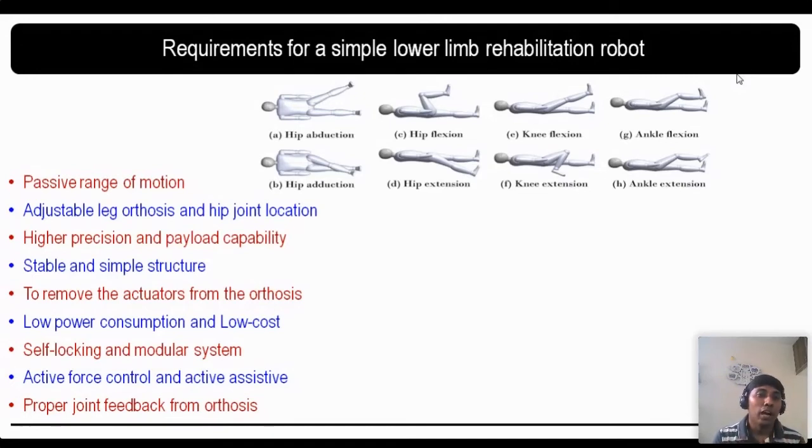And when we do, for example, upward and downward exercise, or even a gait exercise in a sitting position, it needs to be adapted. Apart from that, as I already mentioned, passive is the prime one, but later on you can bring in the active. When we come to active, there could be two cases. One is completely active, where the patient does all the things. The other one is assistive. Whenever the patient requires it, you would give the assistive system. So obviously your controls are supposed to give passive range of motion, active range of motion, and active assistive motion.